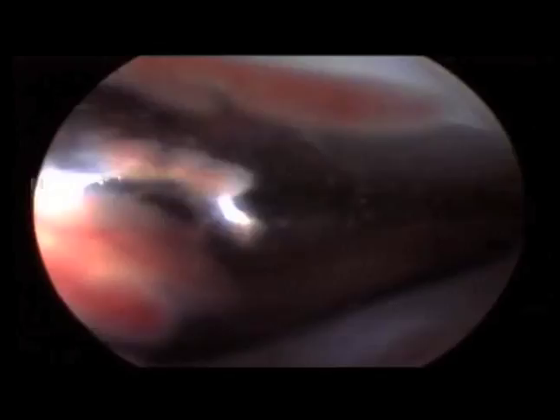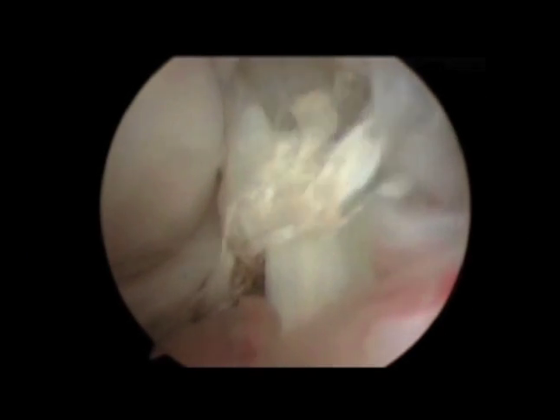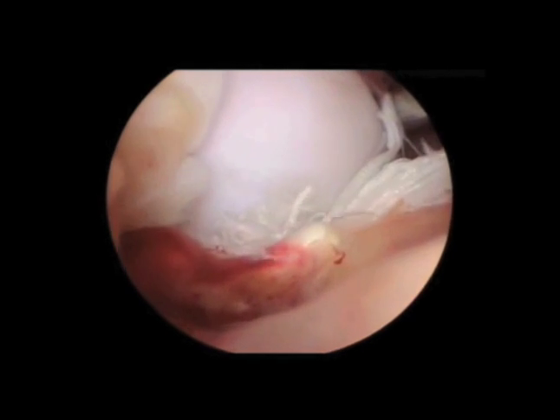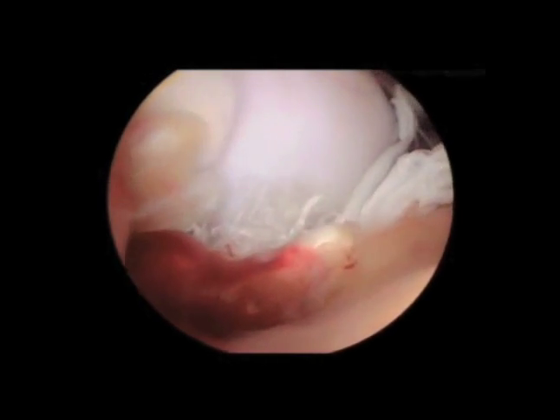Now, that chronic biomechanical wear and tear leads to this chronic breakdown of the ACL that we see in dogs. And I have four little clips of arthroscopic videos that show that. The first is a normal ACL with nice tight bundles of fibers. But next we show one that's starting to degenerate. The fibers are becoming loose, discolored. If we push on them with a probe, we find that the ligament appears soft. And this ligament will gradually start to fray and end up looking like this patient, where there are actual filaments of the fibers that have torn. That gradually progresses to a full ACL tear, where the fibers are completely pulled apart. We see hemorrhage within the joint, and that is the end result of this chronic biomechanical wear and tear.